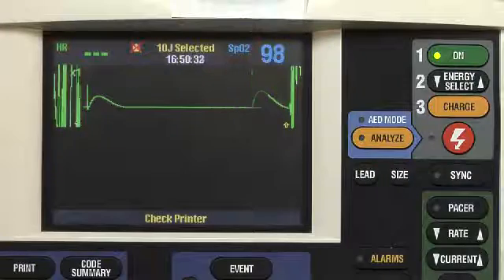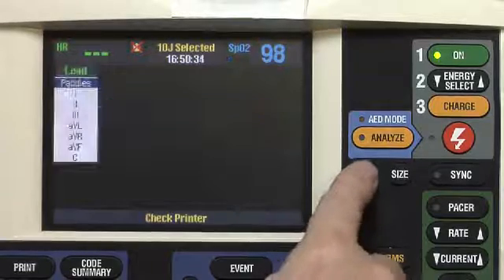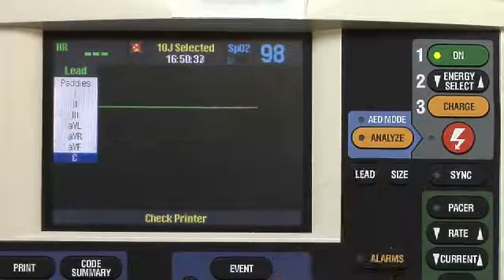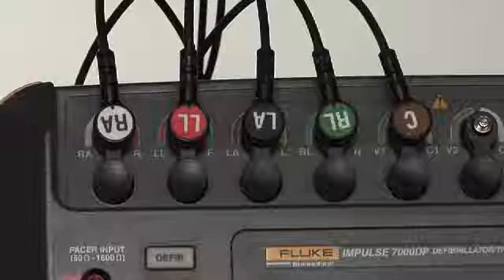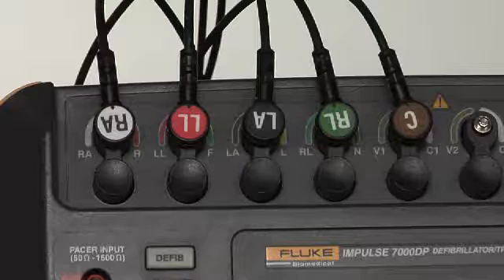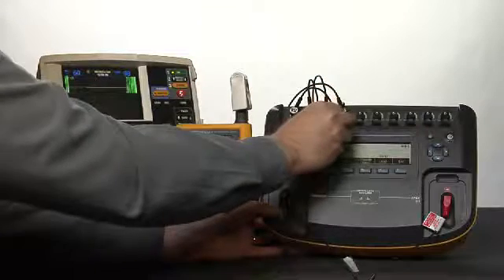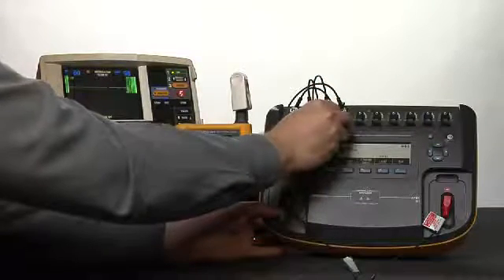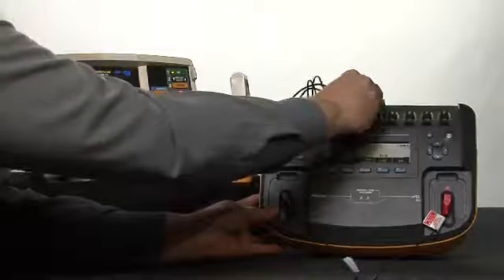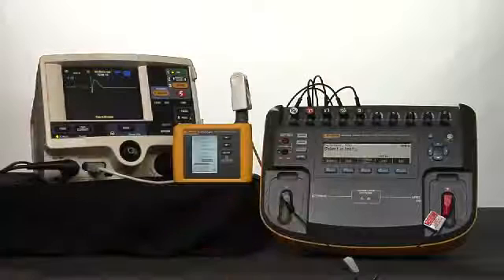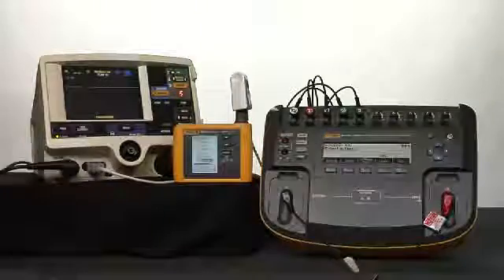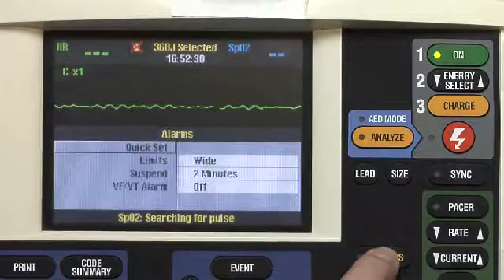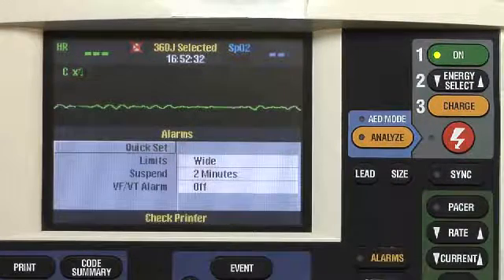Set your device under test lead selection to lead C. Lead C selected. Remove the C lead from the Impulse 7000 and verify that the device under test displays a C leads off screen message. C lead removed, C leads off screen message displayed. Now reconnect the C lead and continue. C lead reconnected. At this point we want to also make sure that the alarms are on on our device under test. Alarms are on.